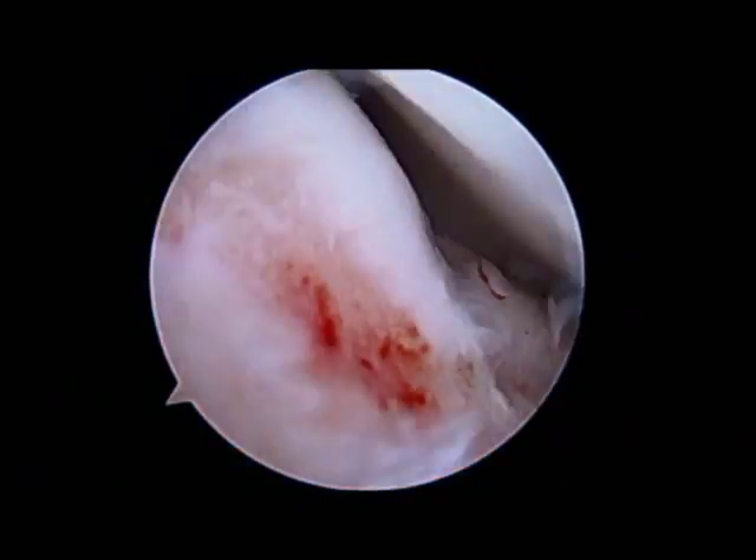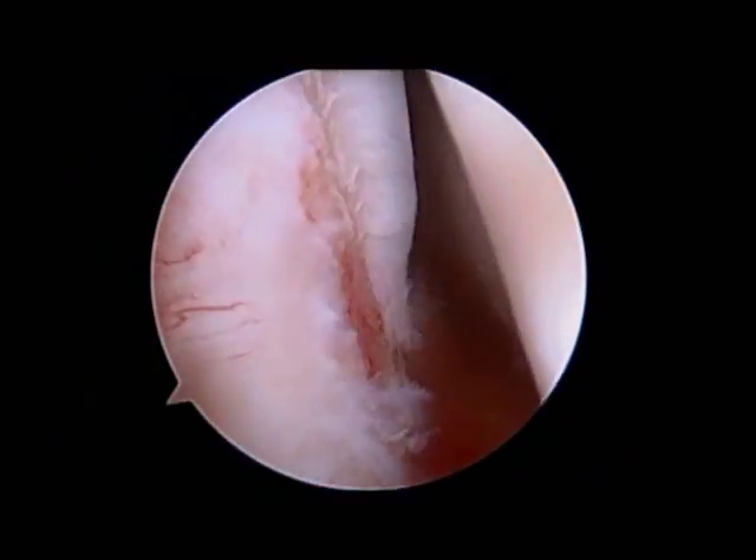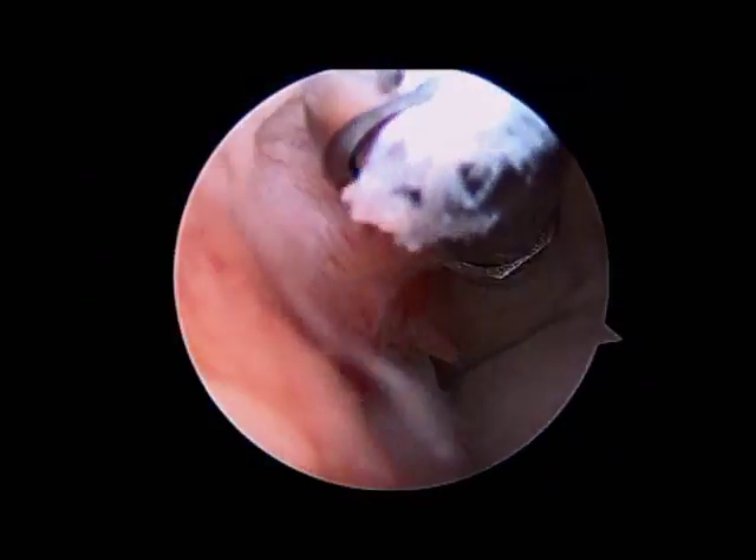A stability exam is performed while we're back here, and we confirm that the joint is tight and stable even under stress, because sometimes an unstable elbow can feel like a clicking and locking elbow.